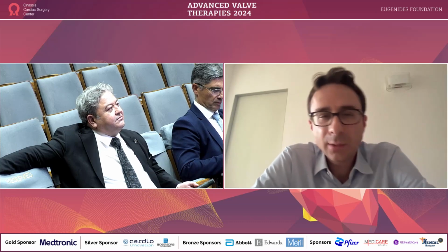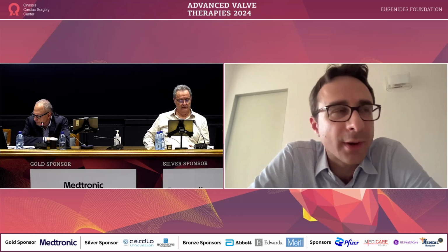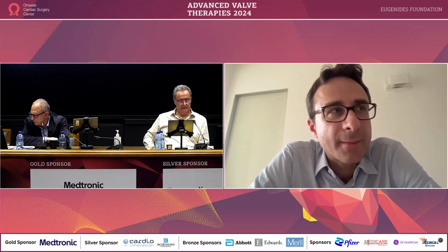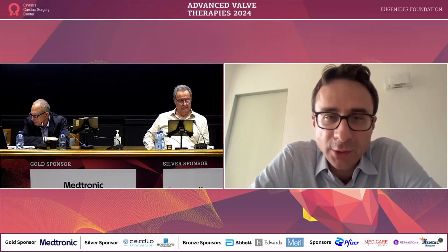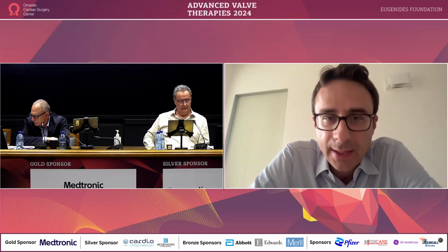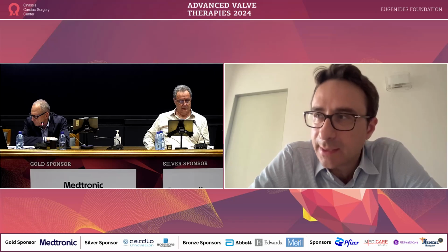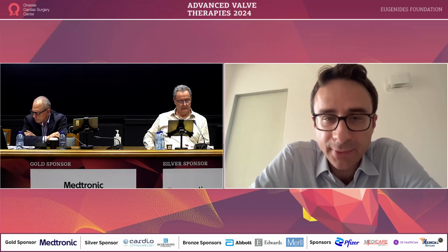Yeah, when I deal with these not so common anatomies, in which the typical inferior posterior puncture probably should not work, I always try in my hospital to perform also the CT, and then I try to identify the specific site for the puncture by using the CT.